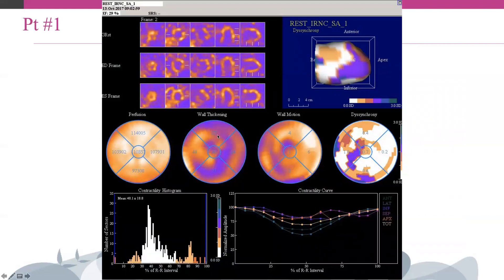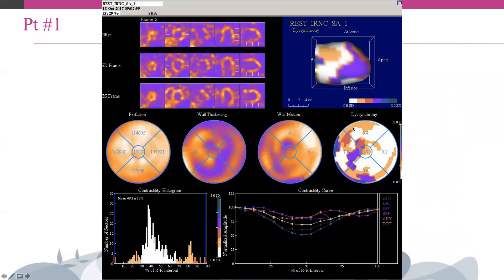A phase distribution is generated by integrating the phase analysis of all different myocardial regions, providing a comprehensive assessment of the global degree of synchrony of the left ventricle. The phase distribution can be displayed in a polar map and in a histogram.